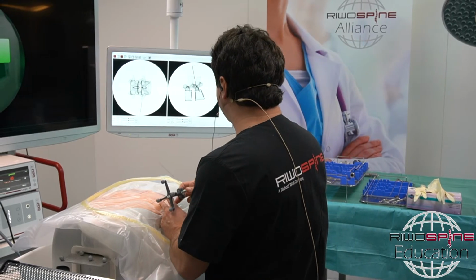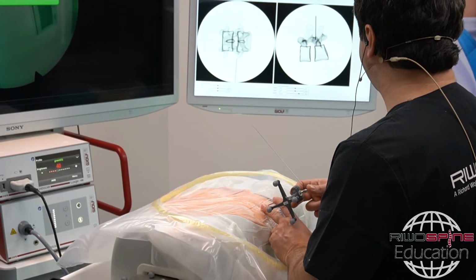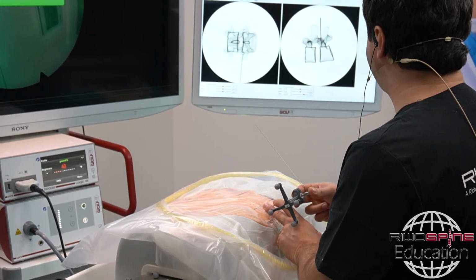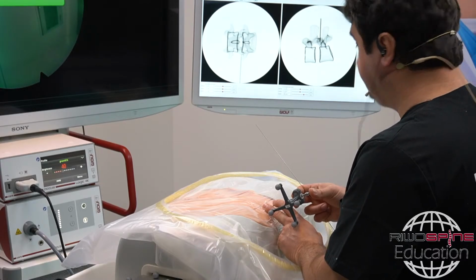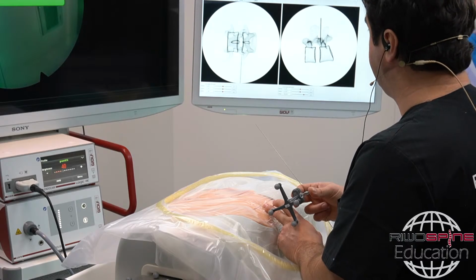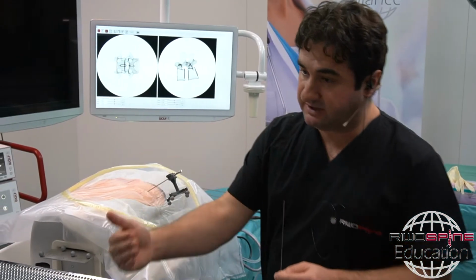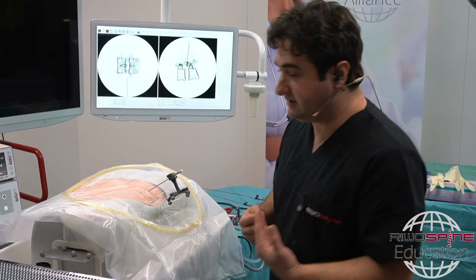You can dock your needle at the caudal junction of the pedicle to the ascending facet, like that. I can feel the bone here. Then this is the safest way to start the operation. Again, if you see a free space at the caudal side, then you can do the regular transforaminal approach and pull the system back a little bit outside of the foramen.